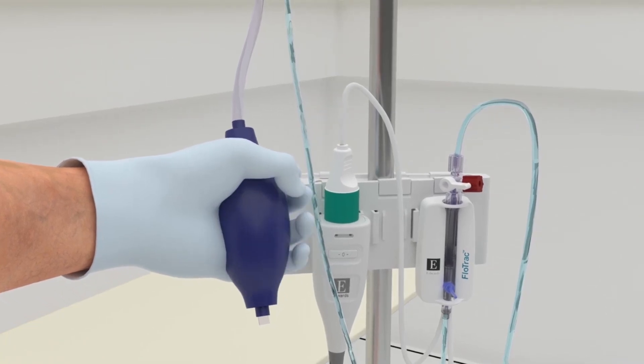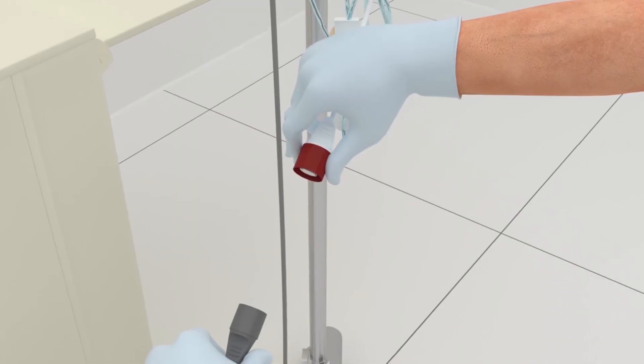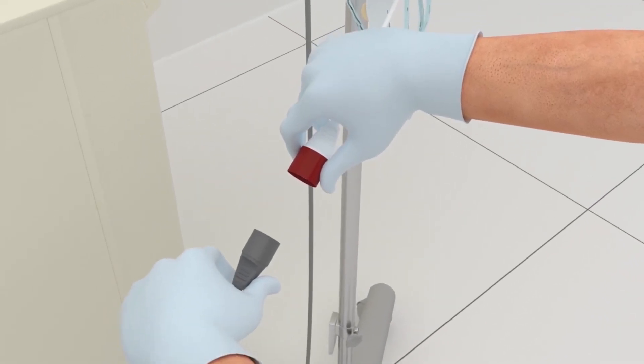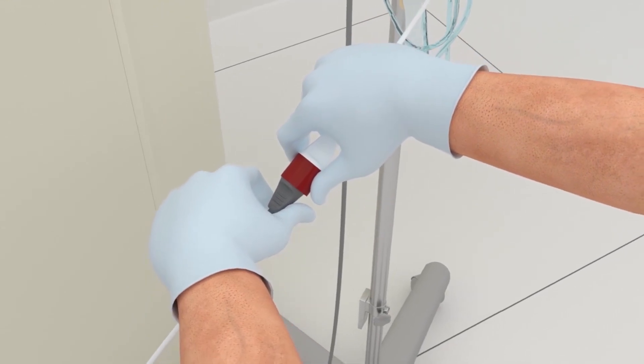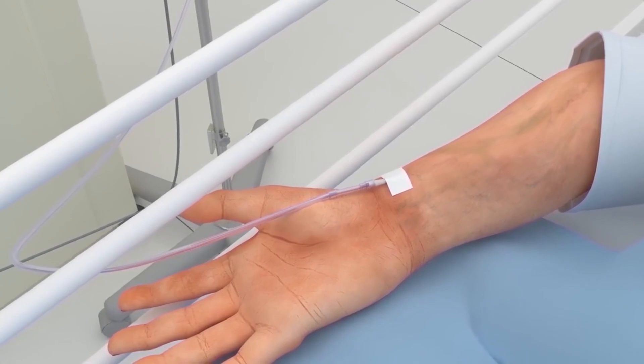Pressurize the pressure bag until it reaches 300 millimeters of mercury. Connect the bedside monitor's arterial pressure cable to the red cable connector on the FlowTrack sensor. Connect the tubing to the arterial catheter.